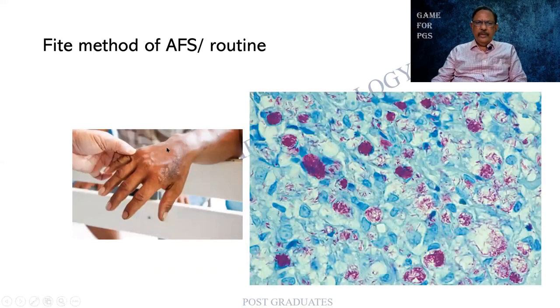Look at this one, the Fite method. There can be a routine acid-fast stain, or there can be a modification of it. This is a modification in which I am seeing. And the background can be by means of the methylene blue.